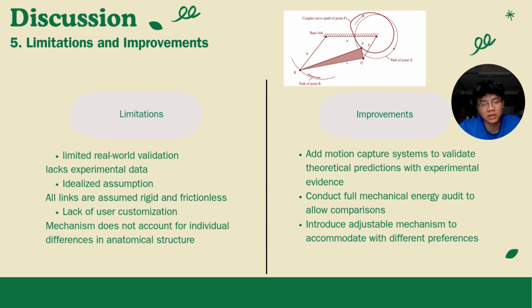Up next, we have the limitations and improvements of our study. First of all, we have limited real-world validation because the study is largely theoretical and lacks experimental data. So how to improve it? We can add motion capture systems that validate theoretical predictions with experimental evidence.